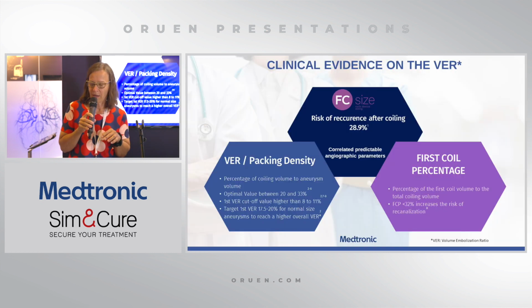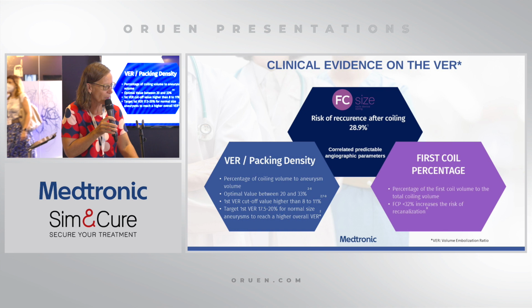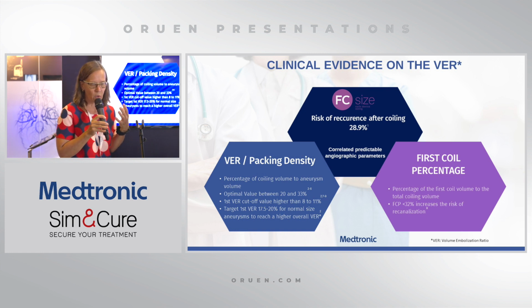So I'm not sure if everybody knows what VR stands for. It's the volume embolization ratio, and that's what we are talking about here. So first of all, coiling in itself, it depends where you are and how big the aneurysm, but it can be up to 30% of the coiling procedures that you get recurrence.